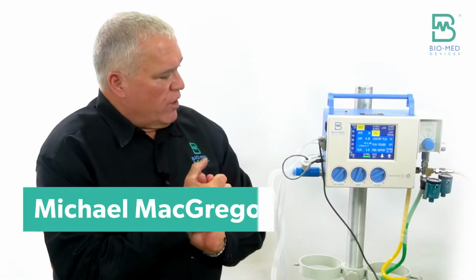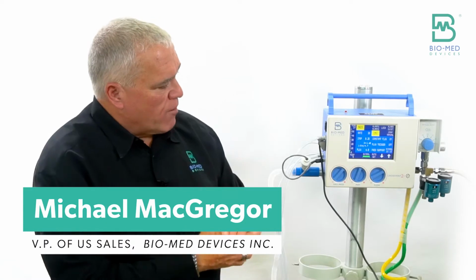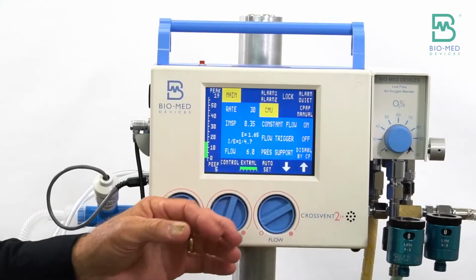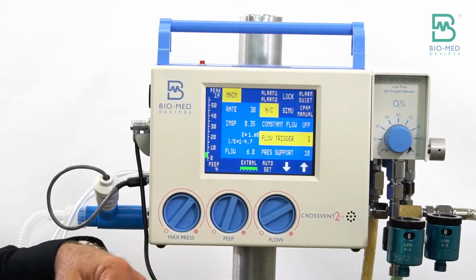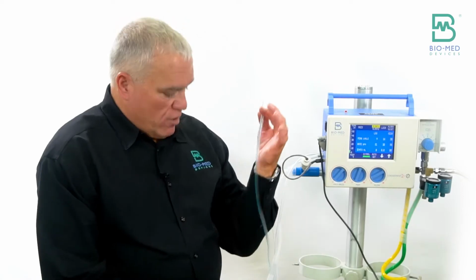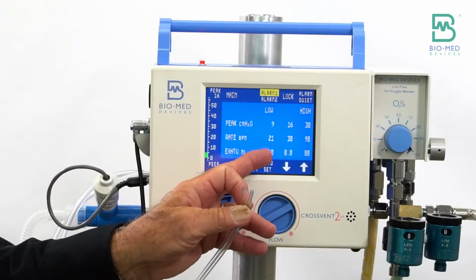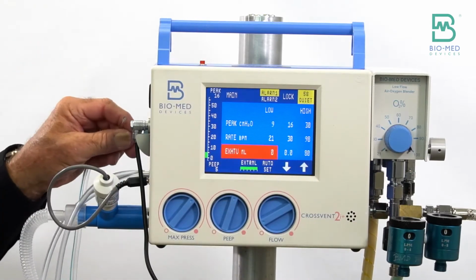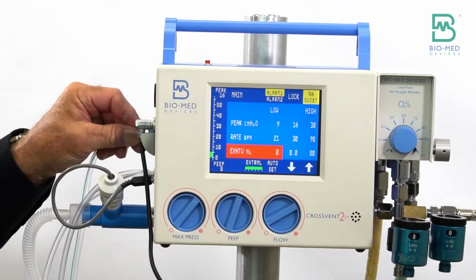If you're going to use the vent with flow triggering, so for most transports and intubated patients, you'll want to switch the vent to flow trigger. You need to actually have the flow sensor plugged in, otherwise it's alarming. It's trying to read a volume and it can't unless the flow sensor is in line.